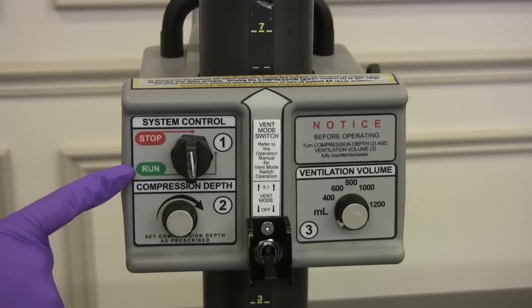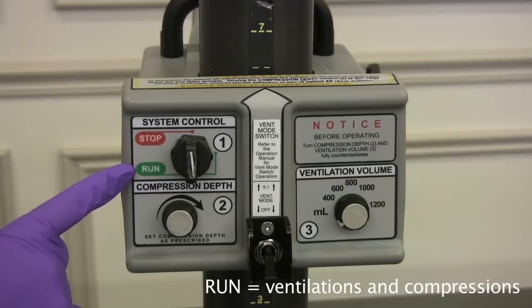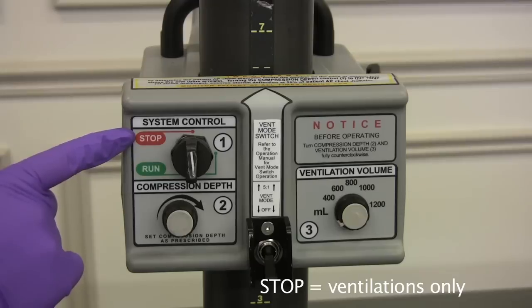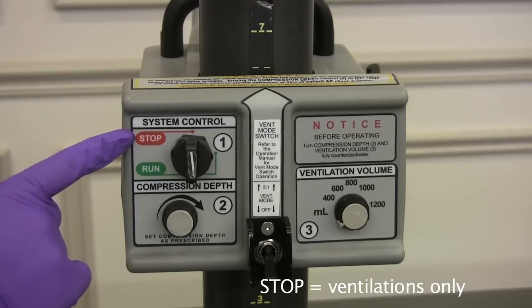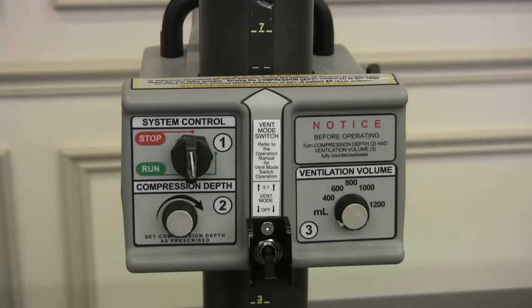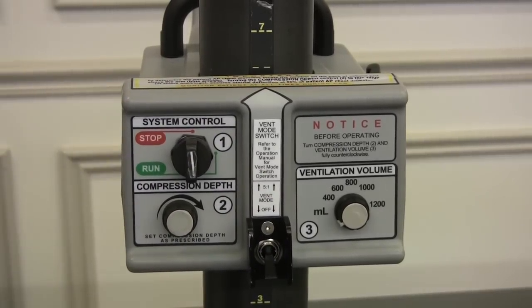When system control is in the run position, the system is operational and ready for use. You can do ventilations and compressions in the run position. In the stop position, chest compressions are disabled and not available, although ventilations are still available and operational. You always want to make sure that this is in the off position — it is off. This would be on, so it's good it was in the off position.